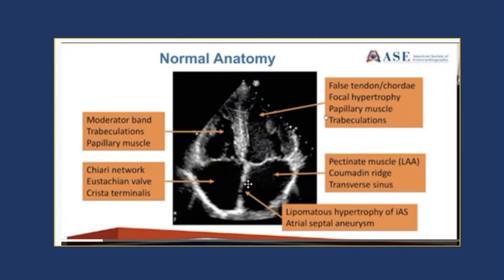Within the interatrial septum you can have lipomatous hypertrophy of the IAS. What that looks like is fatty infiltrates of the septum in the bottom and top parts, with a thinning in between where the foramen ovale lies. It kind of looks like a dumbbell shape and can be very prominent and unusual-looking in many cases.